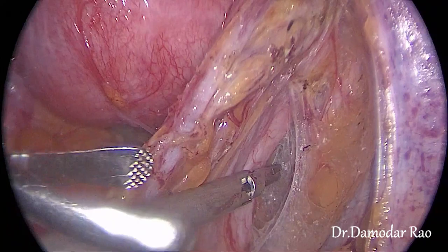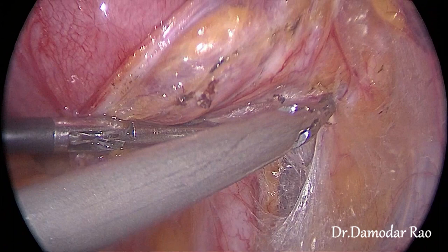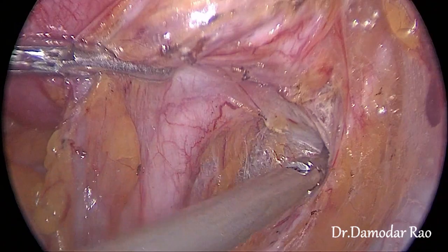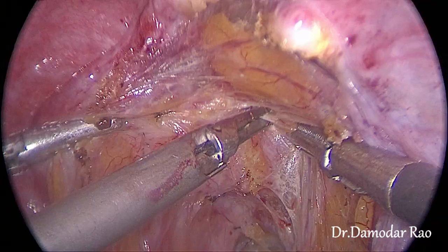I hold the tissue near the ureter and pull it medially, cutting the tissue parallel to it. As I keep cutting the tissue, we come across a structure that crosses the space from lateral to medial. This is the uterine artery. The uterine artery is peculiar in that it is slightly bluish in color, it is tortuous, and it has various patterns like a C-shaped and a U-shaped.